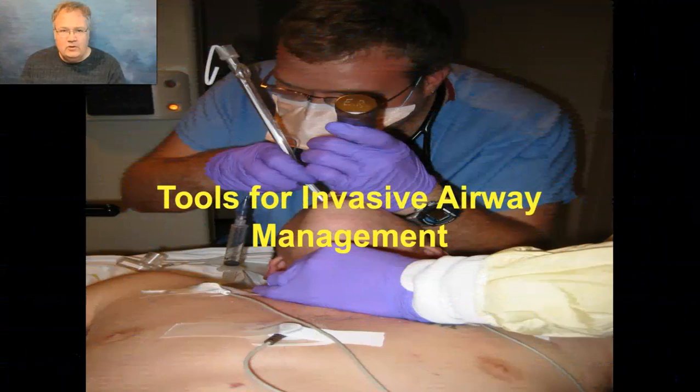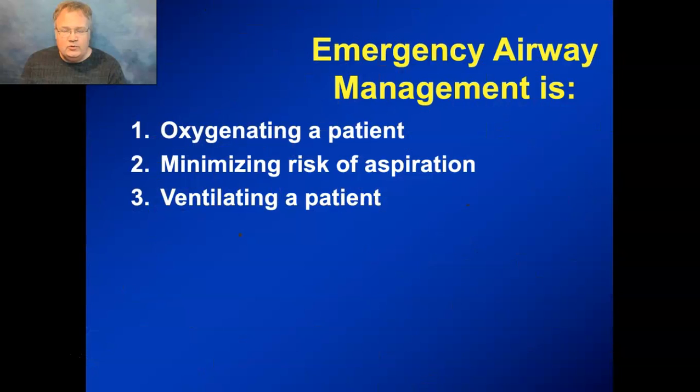All right, well, next I want to talk about some tools for invasive airway management, specifically for intubation. And there's really two tools I want to talk about. And remember, the whole point of our emergency airway management is to oxygenate the patient first and foremost. That turns the emergency into the urgency. When they're oxygenated, you can back off, think a little bit, do the rest of what you need to do. You want to minimize the risk of aspiration and then get rid of excess carbon dioxide.